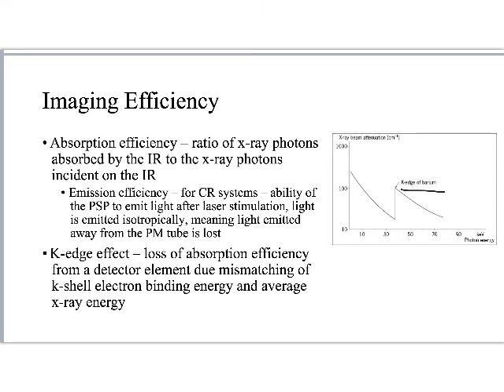If an X-ray photon hits at just that energy or higher, it has the power to liberate that electron. If it hits the PSP at an energy lower than the binding energy, it does not have the energy to release that electron.